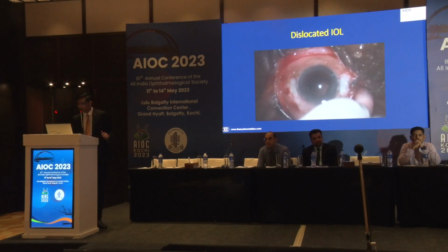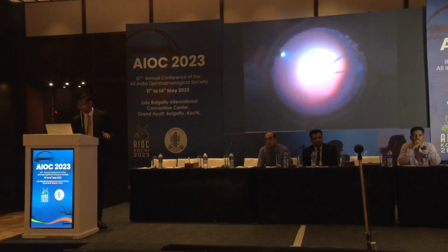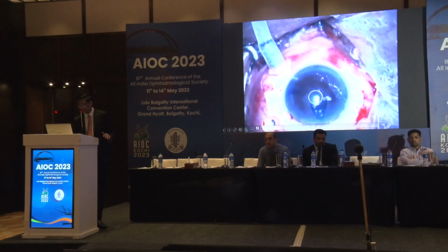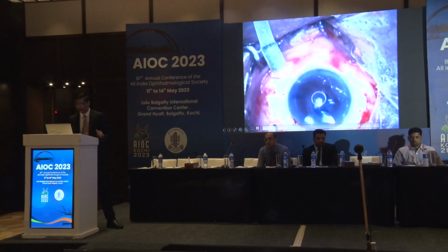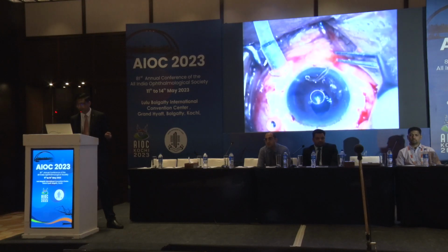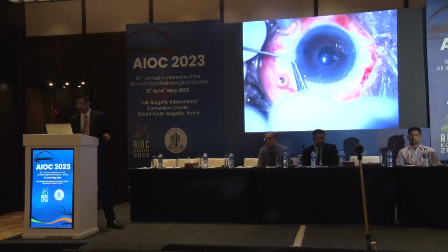So this is another case where there was IOL drop where we cut the lens. We used a lens cutter, without enlarging the incision, we removed it, and then injected a new IOL, and the same technique can be used.